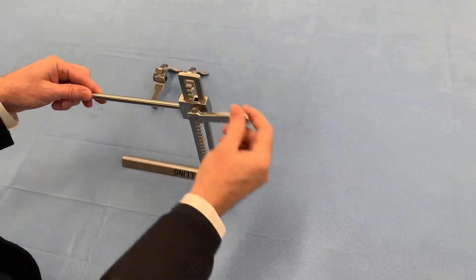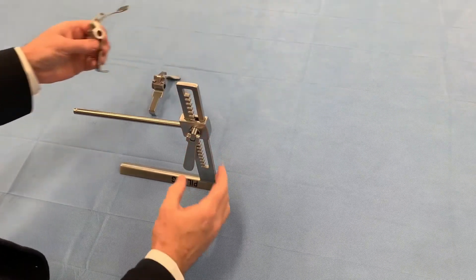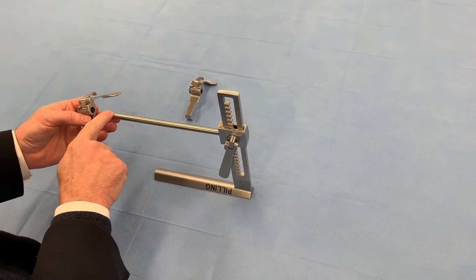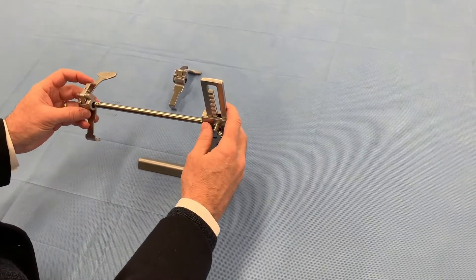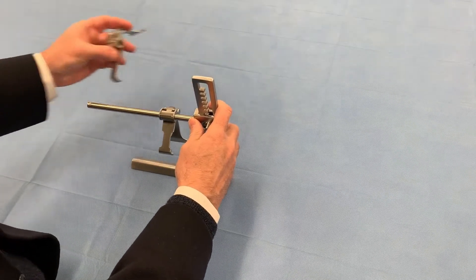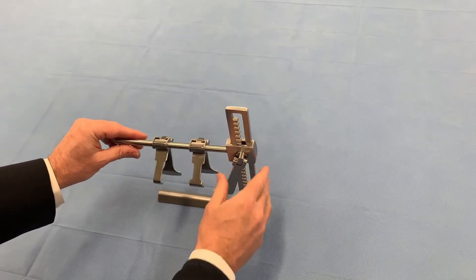It just cranks down. Then you want to put the blades on. There's a little post here, a little ball that holds them on the bar. You just push it over that and go in, and do the same thing for the other one, and you're ready.